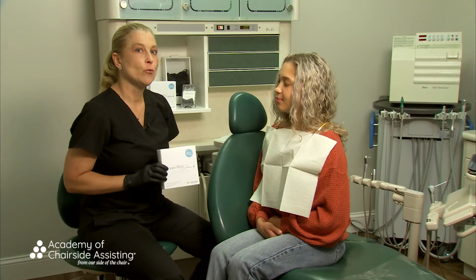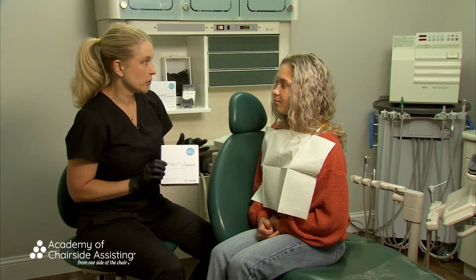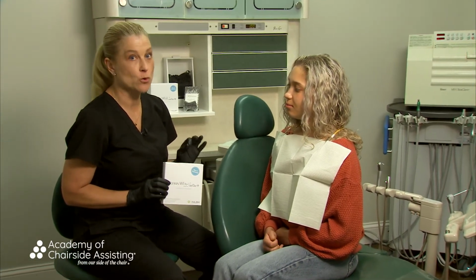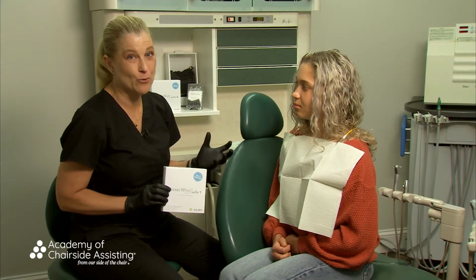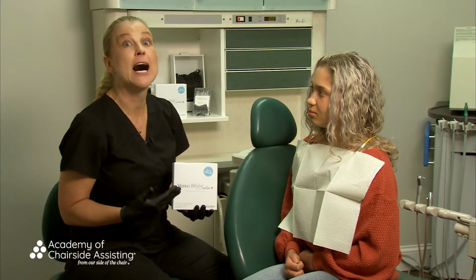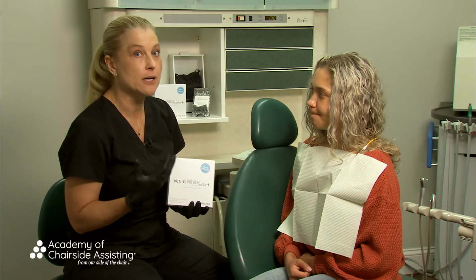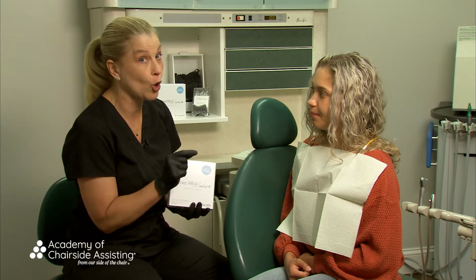So before we start, what I want to go through is exactly how to utilize the Ultra, and most importantly, making sure that Haley understands exactly what she needs to do, because compliance is the most important thing. We know the product is very good and it's going to work, but it's those patients that will do it for a few days and stop is where we really and truly need to make sure that we emphasize that, you know, bleaching comes from time. And in order for Haley to get the best shade change, we want 2, 3, sometimes 4 Vita shade changes. We're not going to get that if we don't really stress the fact that she has to do her part.